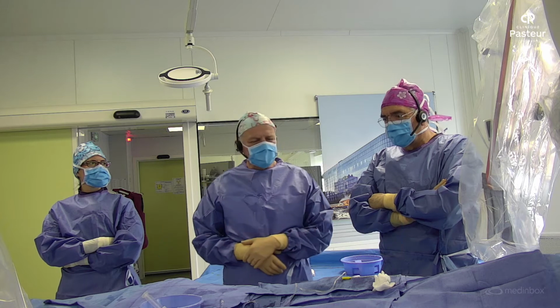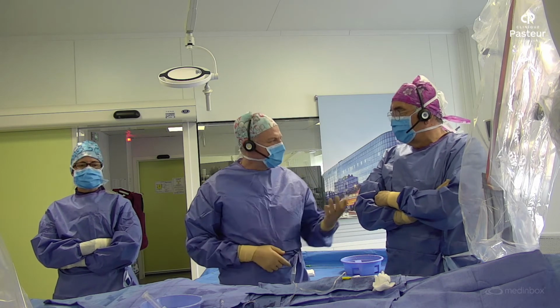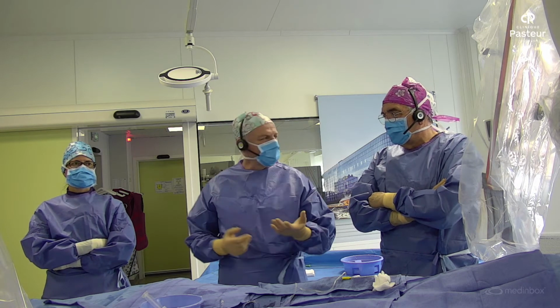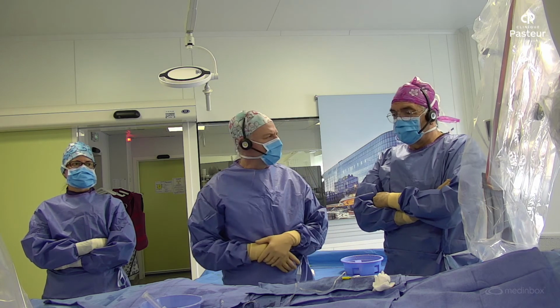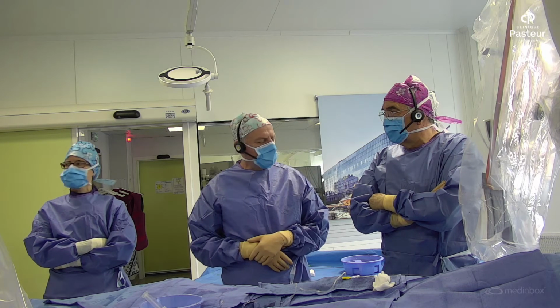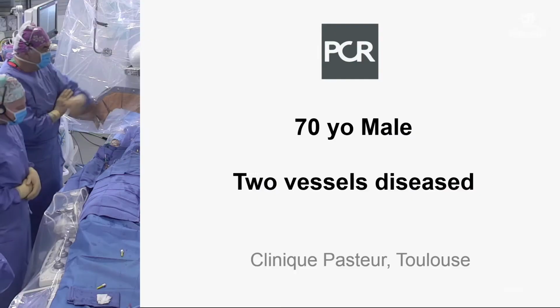So it's really for us a pleasure to perform today this live case from Clinique Pasteur. And the topic of today is to do a case in a patient with a multivessel disease with some complex lesions. So, Jean, if you agree, maybe I can present the case. Yeah. Okay. Yeah. And then we will review.